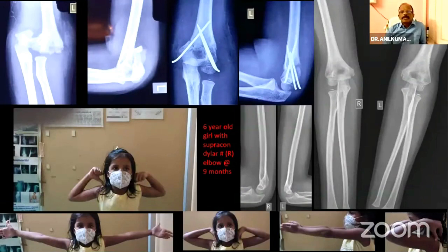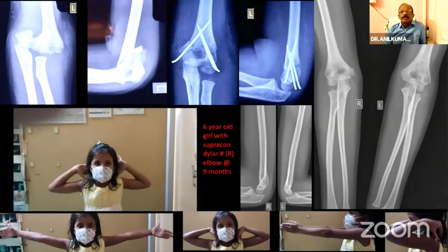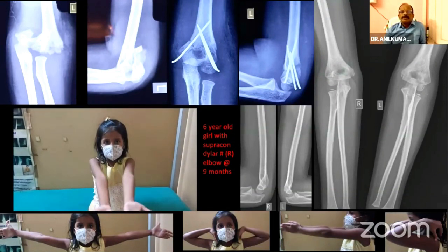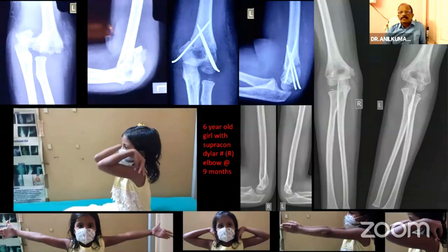And this is a 6-year-old girl with a supracondylar fracture of the right elbow, 9 months after the injury. You can see the preoperative X-ray, postoperative X-ray, and also the X-ray taken at 9 months for evaluating the cosmetic as well as functional results.